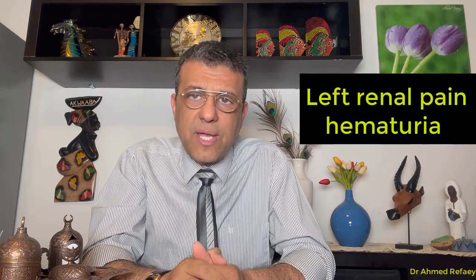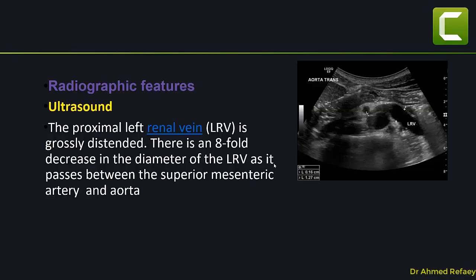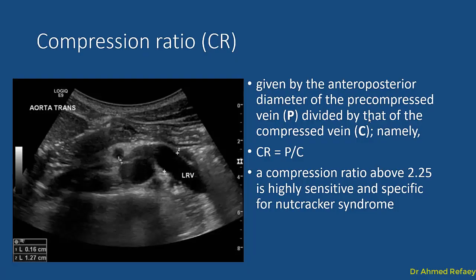Regarding the radiographic features of Nutcracker Syndrome, starting with ultrasound: the proximal left renal vein is grossly distended. As seen in this image, there is marked dilatation of the proximal left renal vein, with at least an eightfold decrease in the diameter of the left renal vein as it passes between the superior mesenteric artery and the aorta. Here we can measure what is known as the compression ratio.